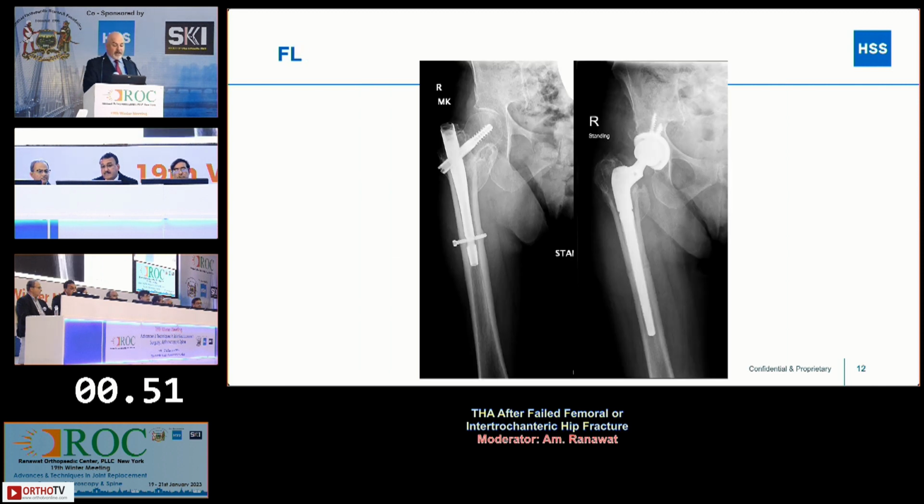All right, here's another case of an intramedullary nail. We bypassed it, okay? So that went longer, but as you can see, the stem is also a little bit down, right? So you have to be able to reduce these hips. These hips can become hard to reduce. And as I said, this is the case where I reamed from the top to get that shot straight down in the trochanter. You have rightly excised that bone, otherwise it would have caused impingement in adduction and dislocation.